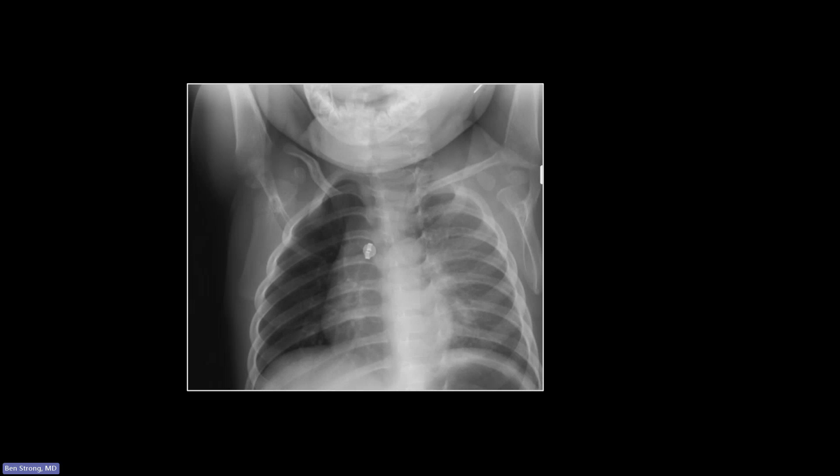Once you start looking at anterior ribs, all bets are off — they're going to be all distorted and bizarre-looking sometimes, especially in pediatric cases. So gauge rib interspace widening by looking at the posterior ribs.